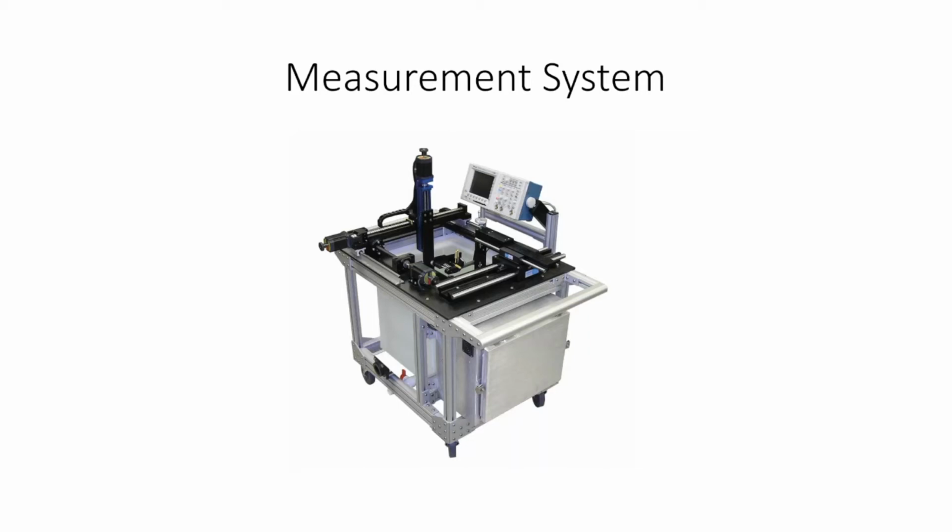While we're primarily focused on acoustic measurements, I did want to point out that another key part of the standards requirements is to actually make thermal measurements, literally measure the surface of the probe with temperature measuring devices to verify that there's no danger of burning a patient in contact. And those measurements are also made with the tissue phantom to evaluate the temperature rise within tissue as well.